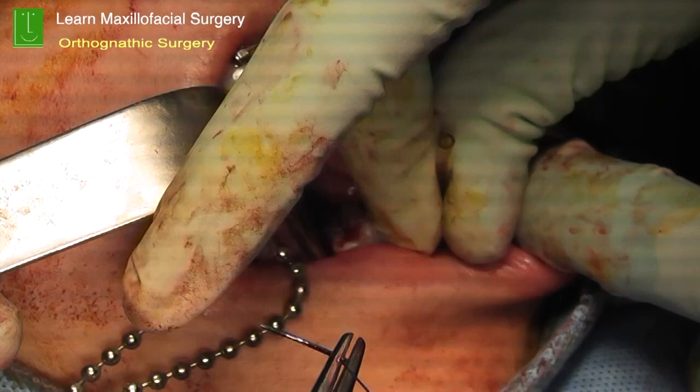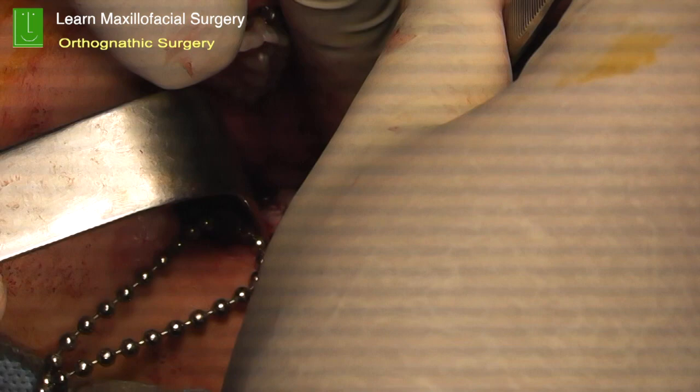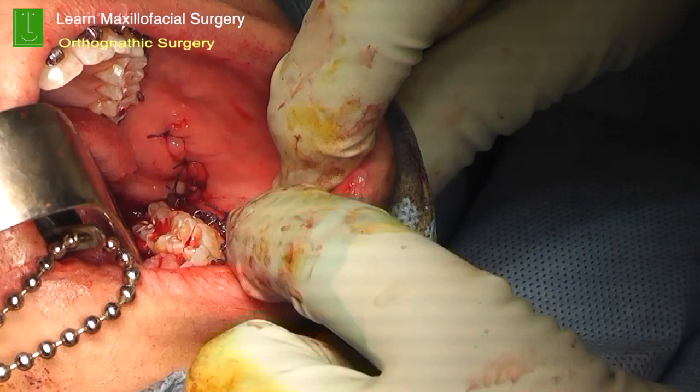That's the fine drainage tube which we are putting in there, and it's gently kept in the vestibule, buccal and labial vestibule. It's a very small tube. Very important that you secure it, because many a times the patient is a bit drowsy after the surgical procedure with the sedation which is being used.